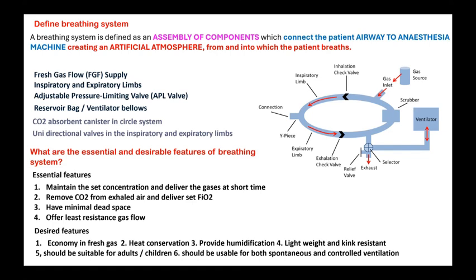Mainly it's used for assessment of respiration. You can monitor the breathing, whether the patient is adequately inspiring and expiring. Very good. That is one function. Then it prevents barotrauma. If there is barotrauma, it can absorb the excess volume and distend. Okay, but there is one important main function for that.